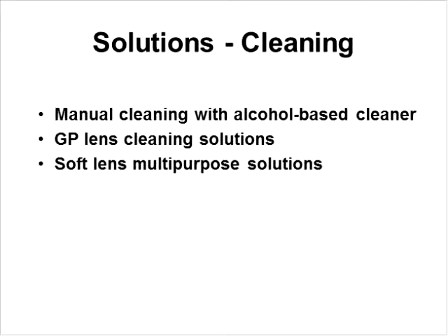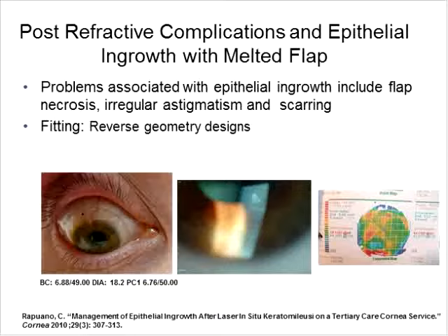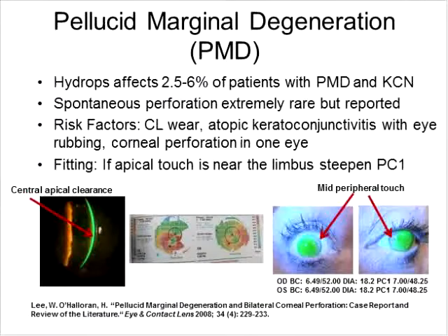I'll pull that slide up. There we go. The central area, if you have clearance in the central area, leave it alone and steepen the first peripheral curve.